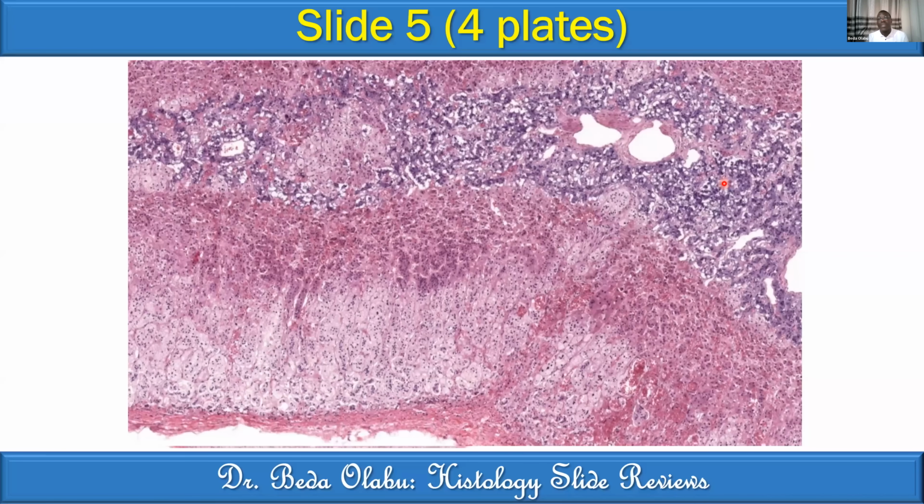Remember how the adrenal medulla is controlled to produce its secretions. Two ways of controlling its secretions. Controlled by the sympathetic division of the nervous system, but also controlled by the secretions of the adrenal cortex through how blood vessels flow from the adrenal cortex to the adrenal medulla. So there is cortical control of the adrenal medulla, and there is sympathetic control of the adrenal medulla. You can check more on that concept.